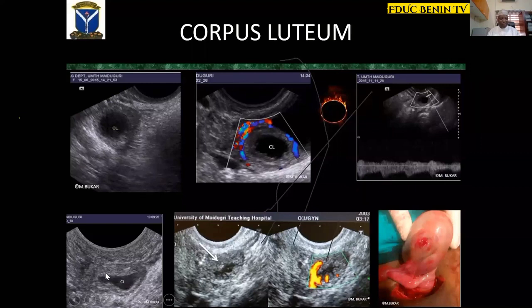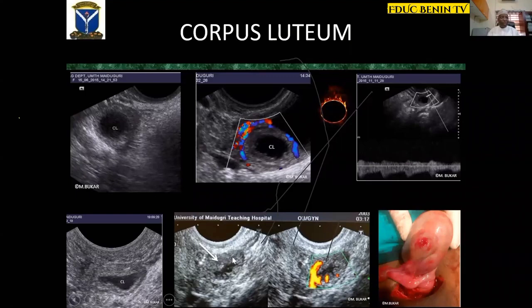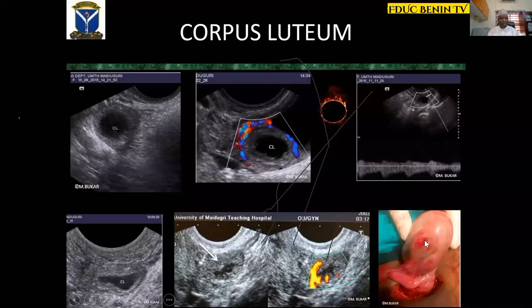Here is another corpus luteum — note the thick wall and an irregular area suggesting the point of rupture, which is easily identifiable when the corpus luteum is less than a week old. Beyond that, you may not be able to identify the area of rupture. This is an old corpus luteum — a corpus luteum that appears as a solid lesion should not be reported as a lesion because it is consistent with normal physiology. When you apply color, corpus luteum has good color flow — try playing around it when you next encounter one to understand what I'm talking about.